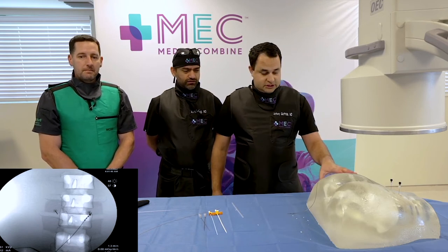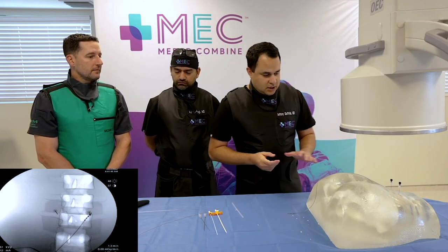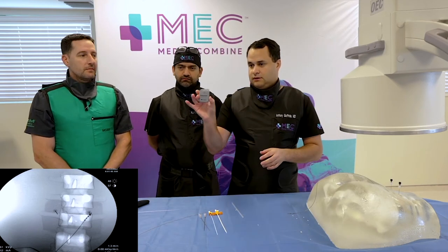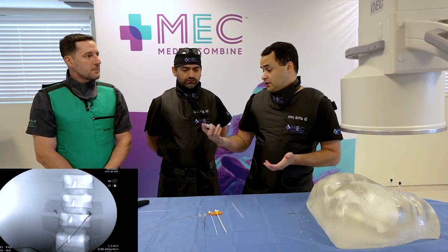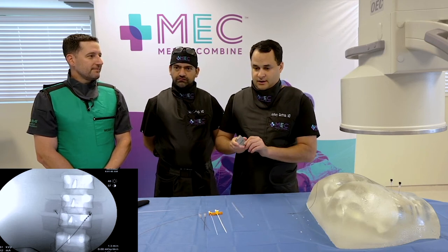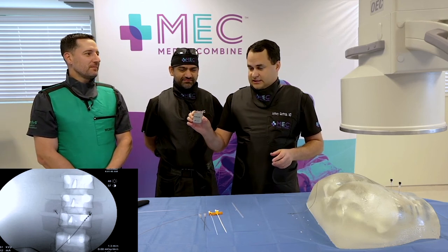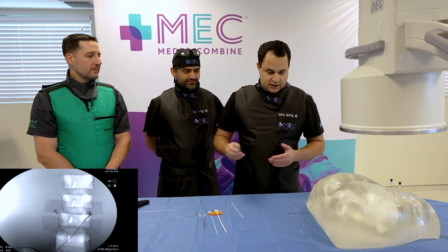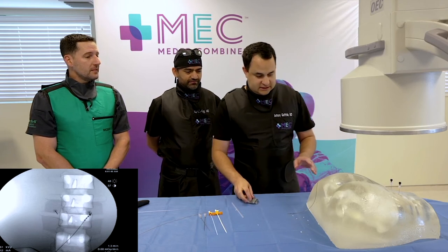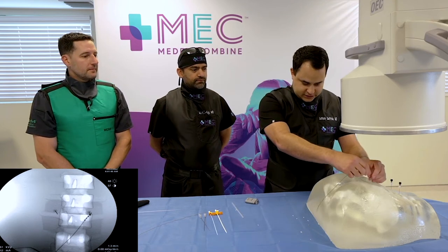To finish up the procedure: there is a battery — very similar to any SCS battery, placed in the flank or buttocks, right or left side, however the patient likes. The key difference is there's no anchoring — instead you make something called a strain relief loop. You create a down-and-around loop with the leads before tunneling to your flank location — this just takes strain off those leads so they're not being pushed and pulled.